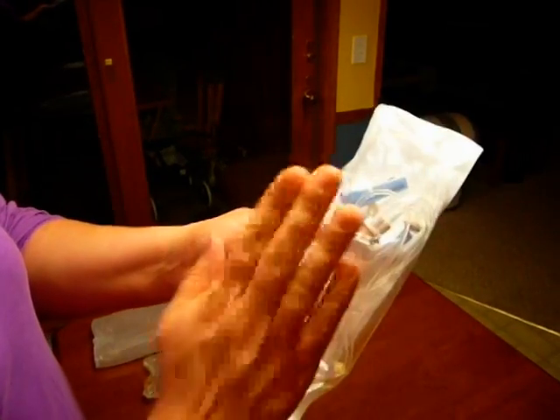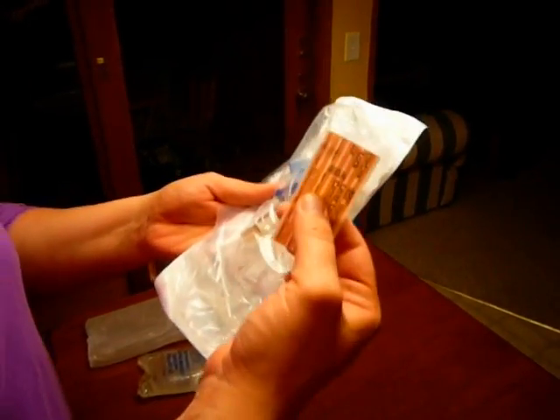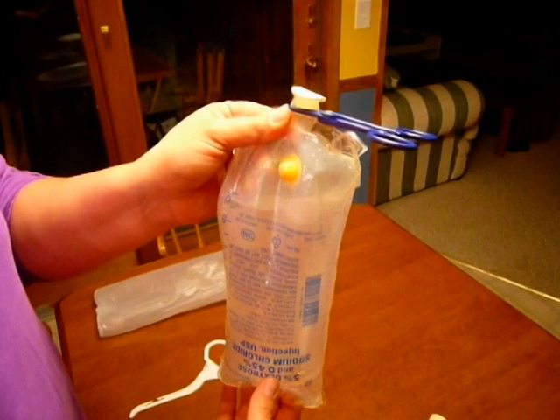So other than that, now you have it back to what it was before. So you have your tubing, you have your clip, and you have your IV bag ready to go. And that's resetting your tubing for practice.